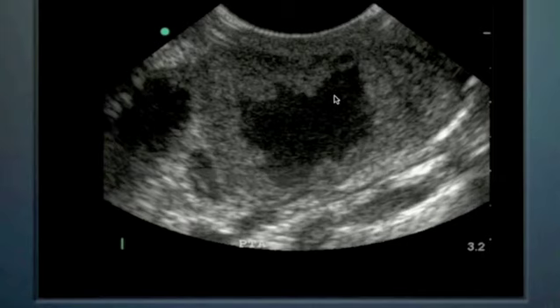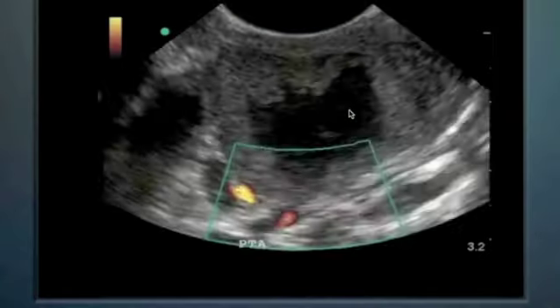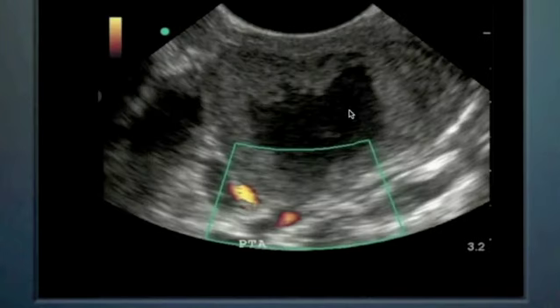diameter peritonsillar abscess. You think about that, it's a very large one here, very prominent, and this is the intracavitary transducer we have in the mouth, and we can see that's a very prominent peritonsillar abscess here. One of the other interesting findings is when we apply color Doppler back here, we can actually make out that there are some blood vessels back here that we want to stay away from when performing the procedure.